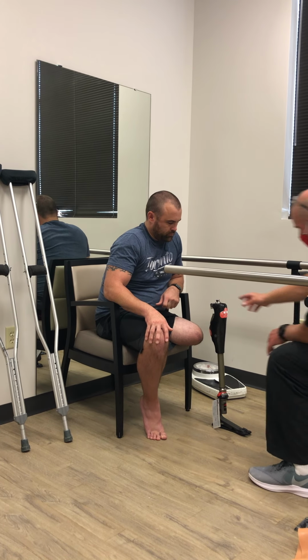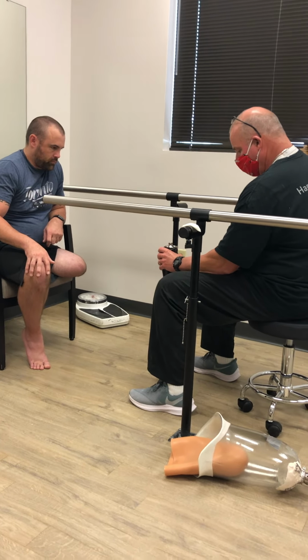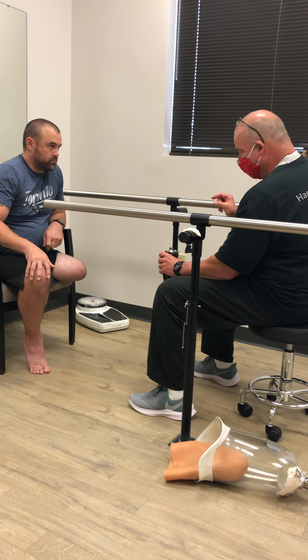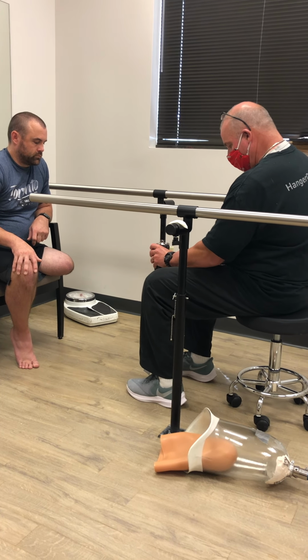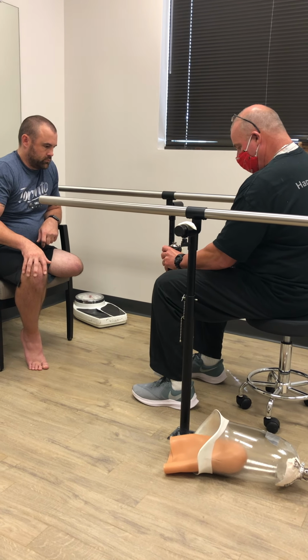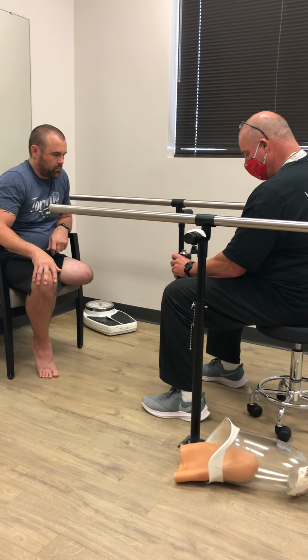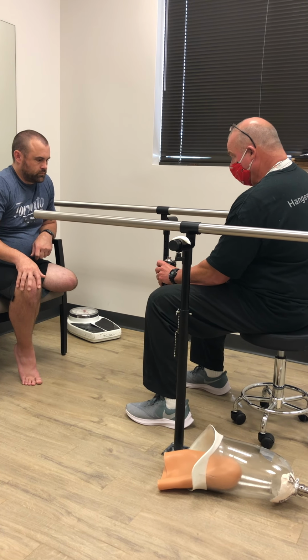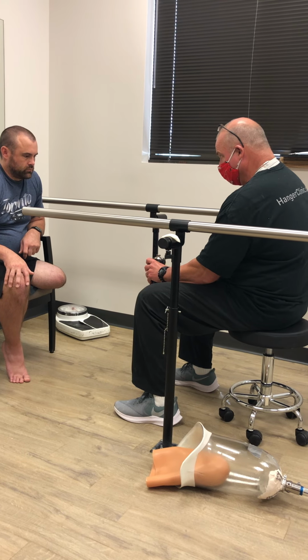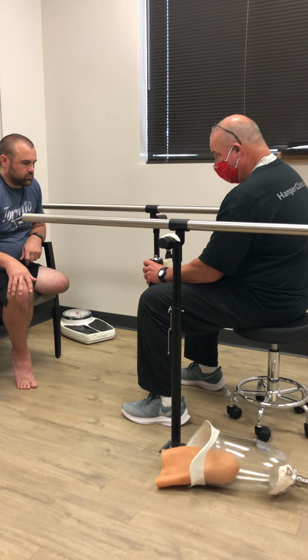And what I mean by that is, if you come in with a tennis shoe, which is typically a 3/8 inch heel height, all the foot shells have a heel height built into them. And that allows me to set your alignment. I always want your alignment to be where the pylon is perpendicular to the floor. So if you're in a 3/8 inch heel, then I'm gonna adjust that pylon so it sits just like that. Now, if you take that tennis shoe off and put on your work shoe, which has a 5/8 inch heel or a 3/4, you see what just happened?